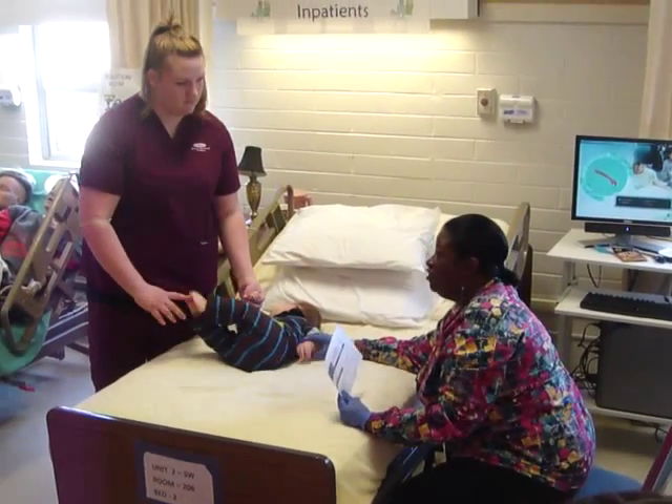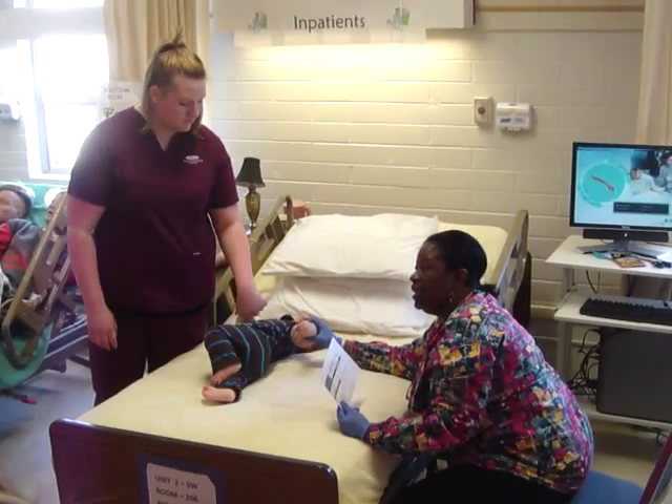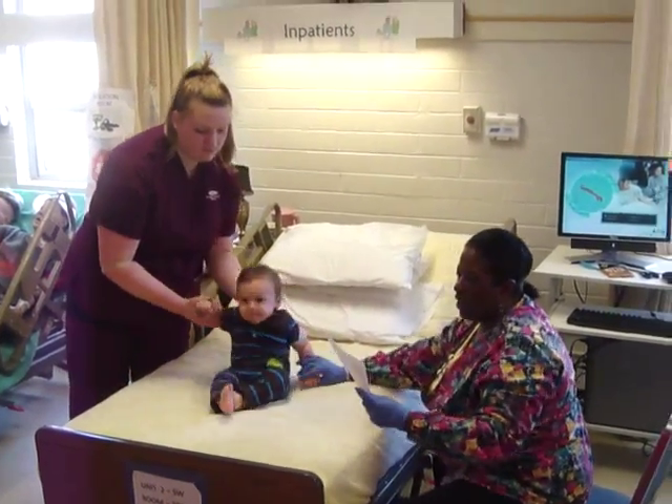If it's an inpatient baby, they're going to have an ID band on as well. Outpatient, of course, would not. I've done the ID.